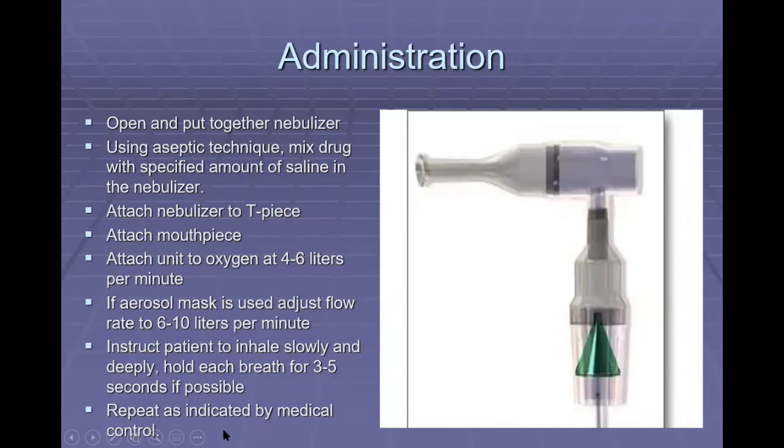All right, so use aseptic technique. Let's make sure that we're using our gloves. We're being very clean. Mix the drug with a specified amount of saline in the nebulizer. Now, some of these medications are pre-mixed, but most are going to require you to put a little bit of saline into the nebulizer as well.